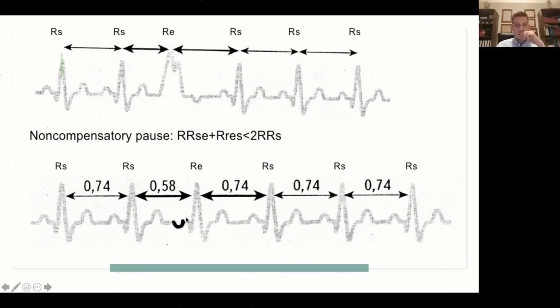On the contrary, here you see an extrasystole firing right here on the bottom. This affects the P wave, so that means that, correct, I just saw the chat, you were all right, that there's an atrial extrasystole that will occur right here, and the compensatory pause is incomplete. Why? Because this distance is not the same as those two here. Does this make sense, or should I say it again?